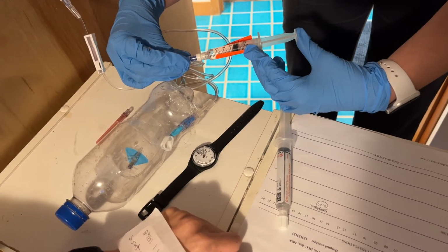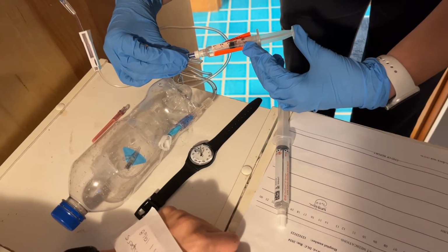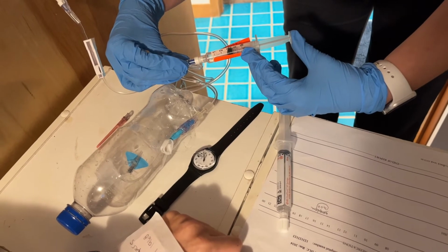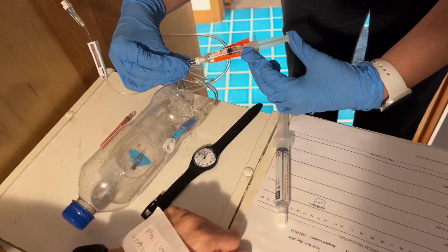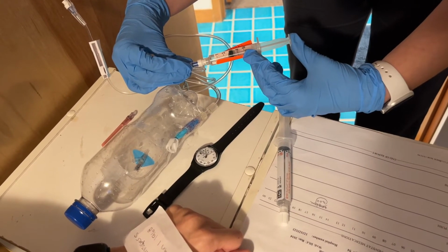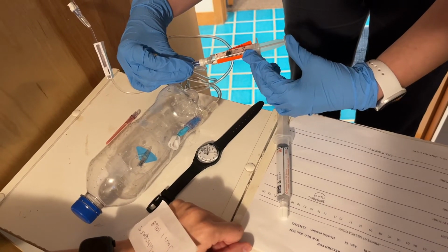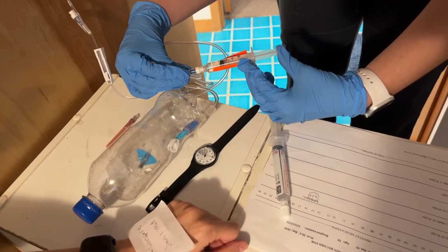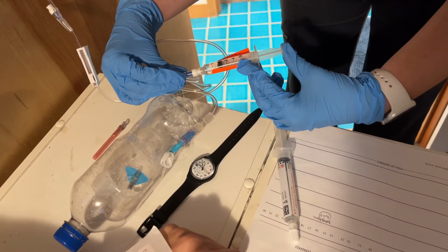Okay, so we are doing 1 ml right now. And I have to stop and wait until it hits 30. And we're gonna do the other ml right now. And stop at 2 and do another ml now.